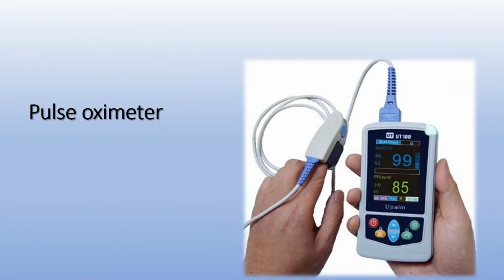What is the pulse oximeter? It's a device that measures the oxygen concentration in the blood. It provides a percent of 100. The lower the percent, the lower the oxygen concentration, and hence hypoxia. It depends on connecting the device to the patient's extremities, for example a finger. This will measure the oxygen concentration in the arterial blood in that extremity.